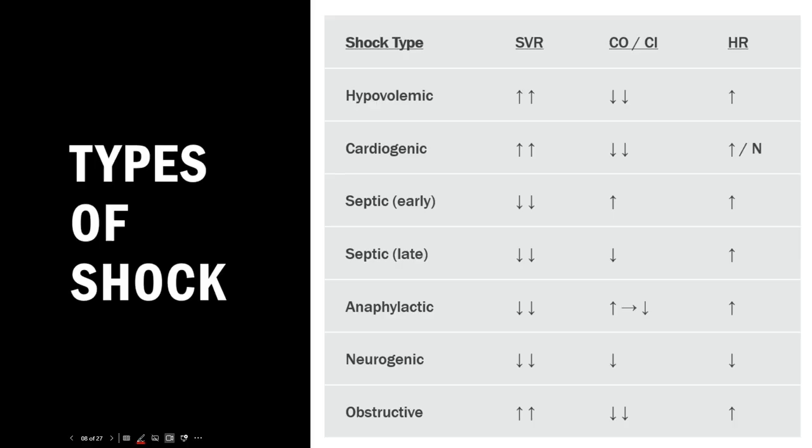If we scan them and that IVC is just plump, it's not collapsible, then we know, hey, they've got plenty of fluid in their heart. We can see this IVC. There's a line to get in that club that goes around the corner. So, fluid is not the problem. Now we need to go into giving them something to help increase the stroke volume. We need something that's going to move that blood forward or to tighten those vessels.